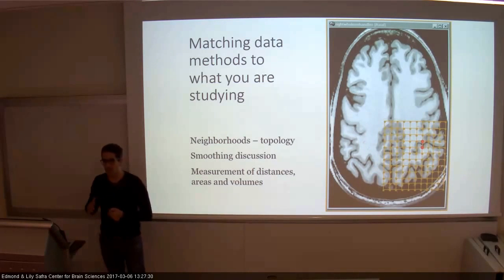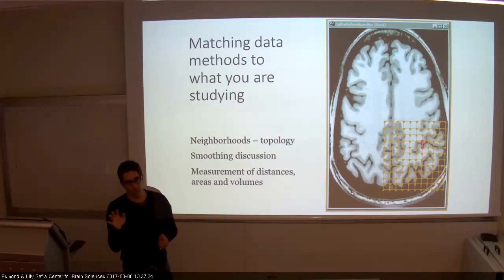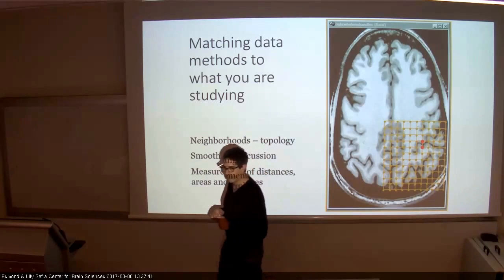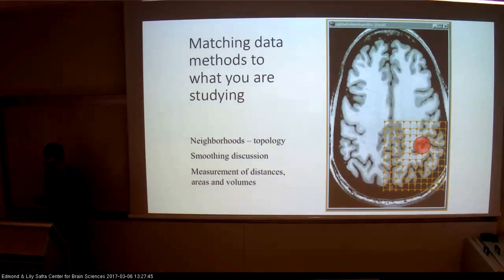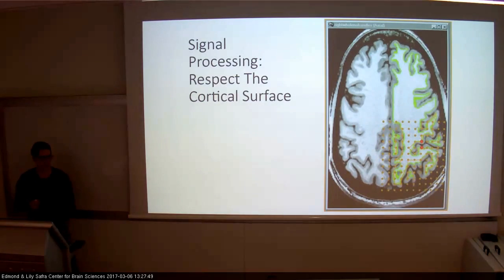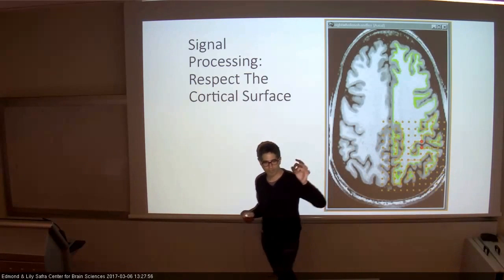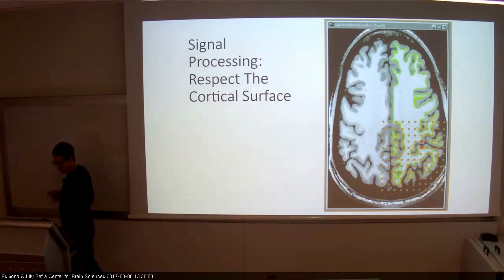So when you hear talks about fMRI, I don't know if they will talk about it. Typically they won't. But you should remember, you can always ask: how did you smooth, in image space or in cortical space? That will change the essential resolution of your measurement. Okay, so that's exactly it. One type of smoothing, a different kind of coordinate, and then a different kind of smoothing. These points now are really far away from each other, and before they were under the same smoothing kernel.